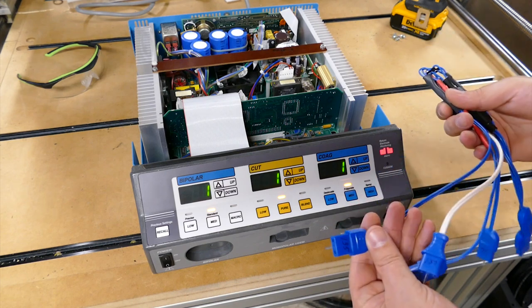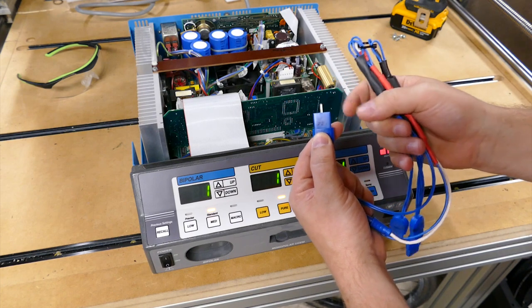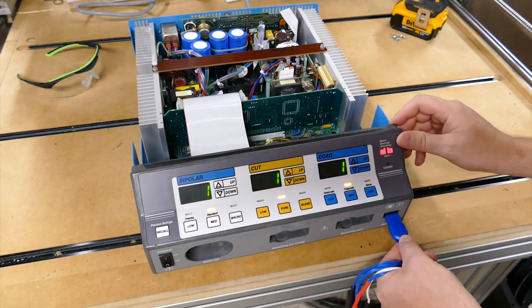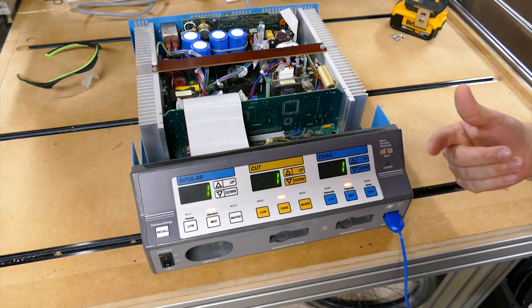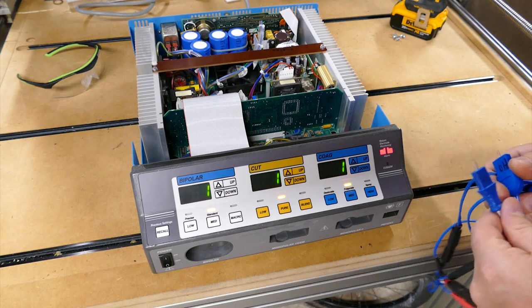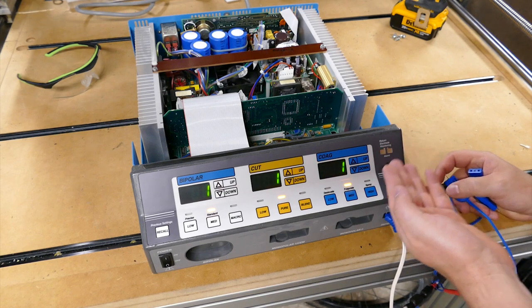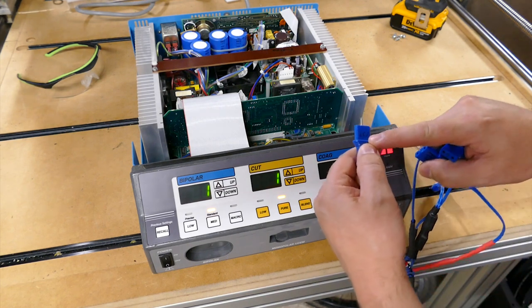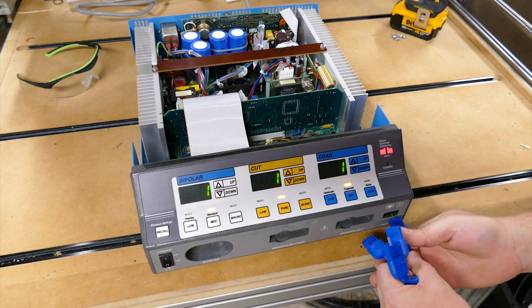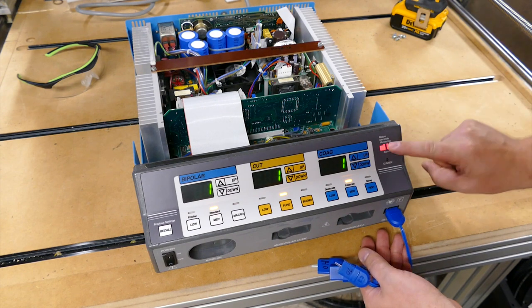And to test these guys, you can either test the dual pad, which has got the little dongle on the cord, or there's the single electrode, which you can see right here with the 10. I plug in the 10, it's absolutely fine. You're supposed to be able to go to 135. You can see I'm getting a red alarm. That one is actually 137 ohms. Let's see, where is my 130? Here's 130. Okay, 130 ohms, it should definitely be showing green.